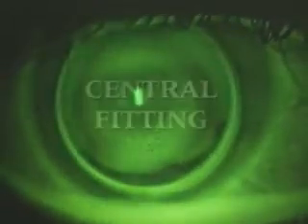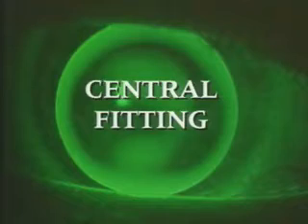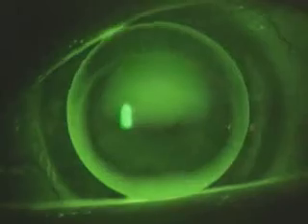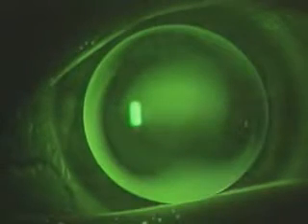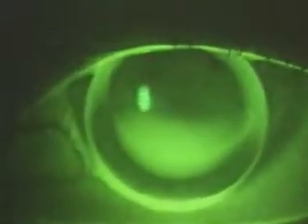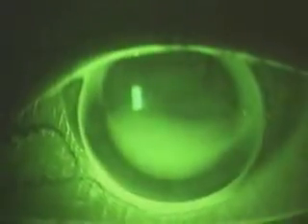Accurate assessment of the fluorescein pattern is crucial for successful fitting of the Rose K lens. If an excessive amount of fluorescein is applied, evaluation of the lens to cornea fitting relationship is more difficult due to the thick layer on the front surface. Central fitting. The fitting pattern should be assessed when the lens is concentric with the limbus. The pattern observed when the lens is decentered can be very misleading and may result in the selection of an inappropriate back optic zone radius.